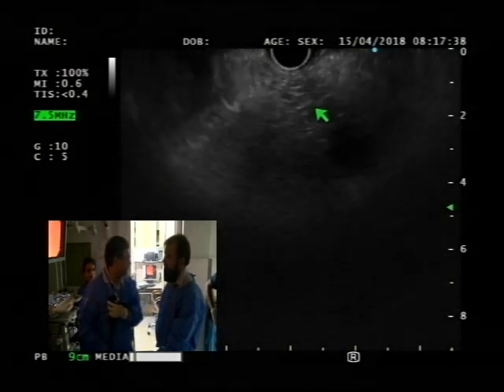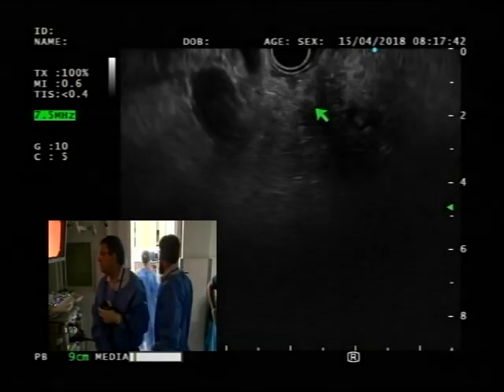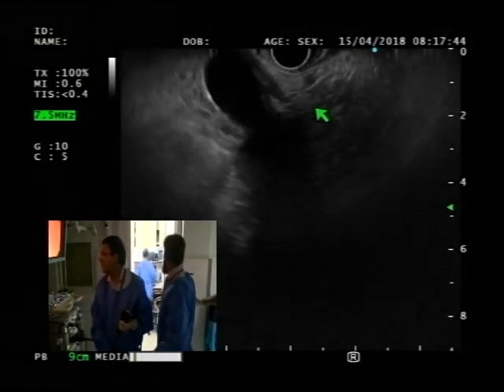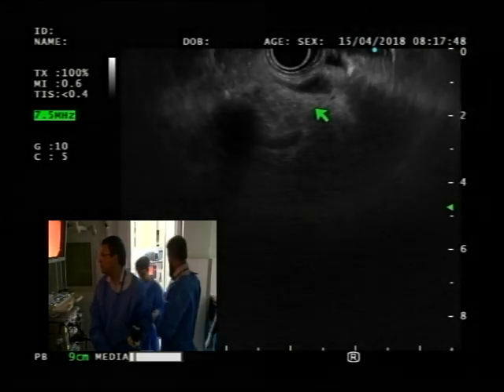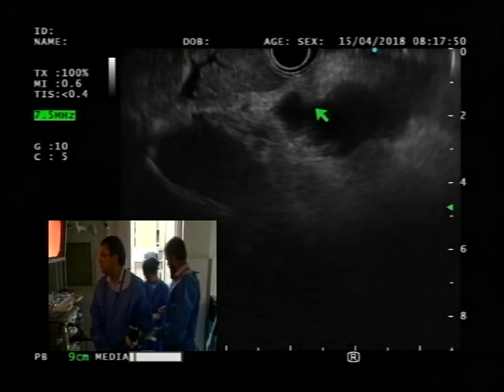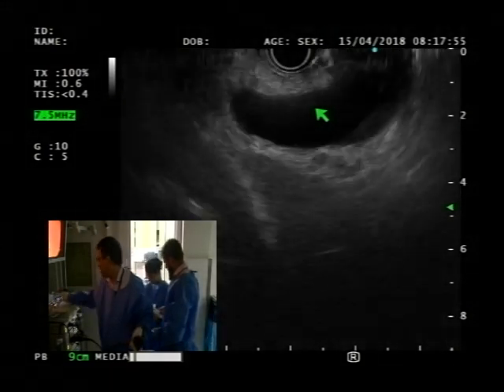And what's the patient's liver test? Anybody knows that? LFTs? That's the gallbladder right there.